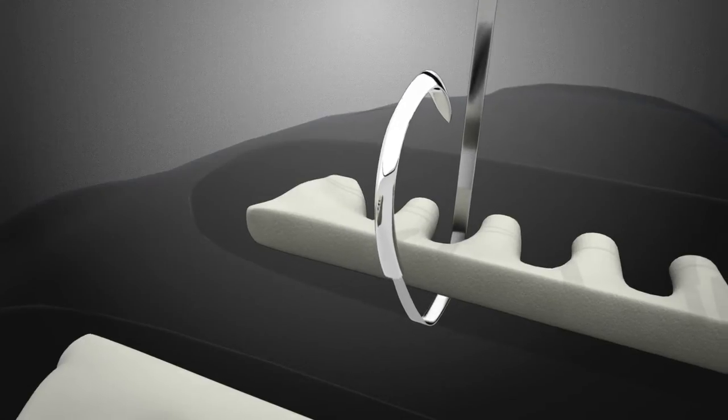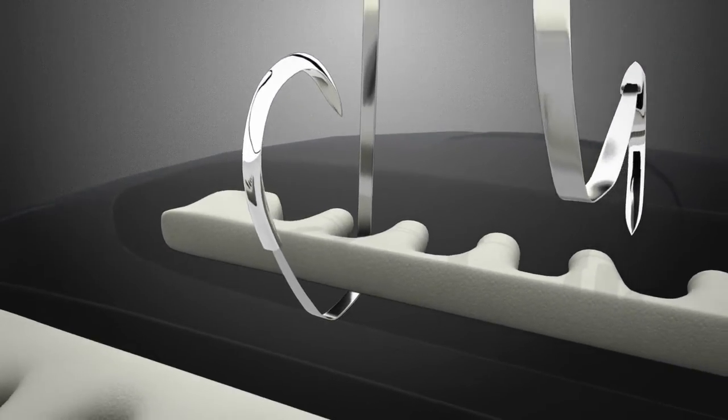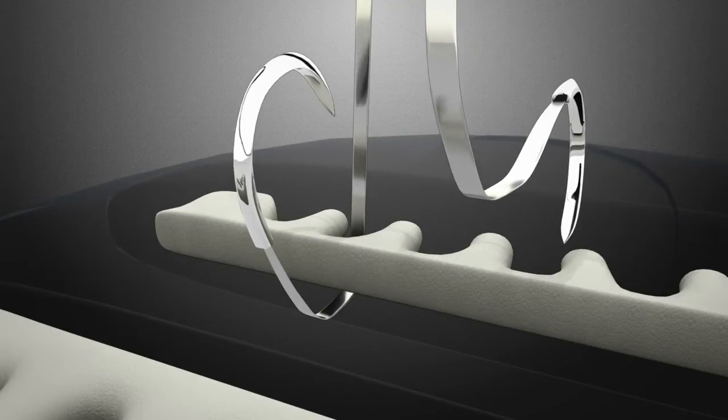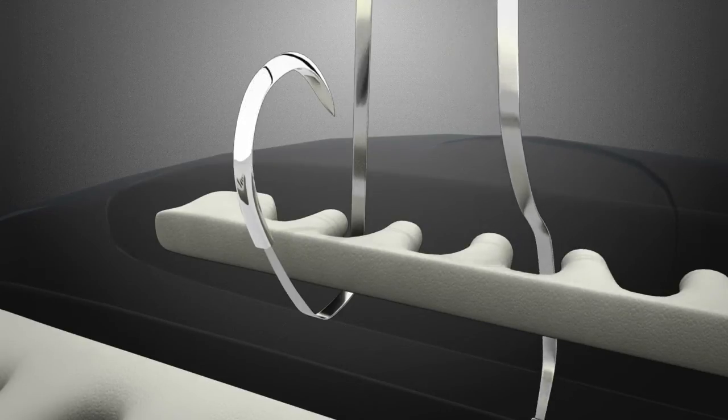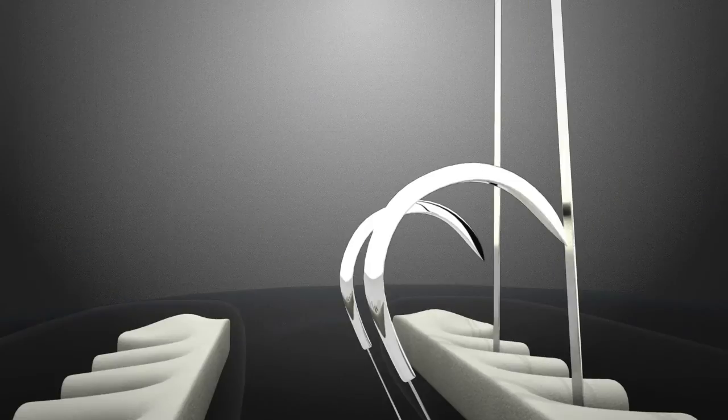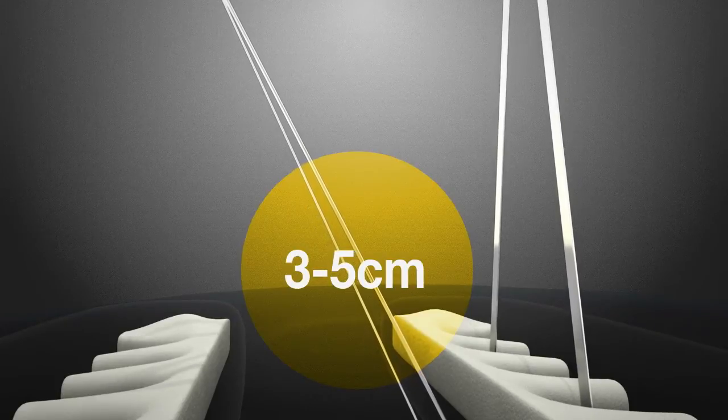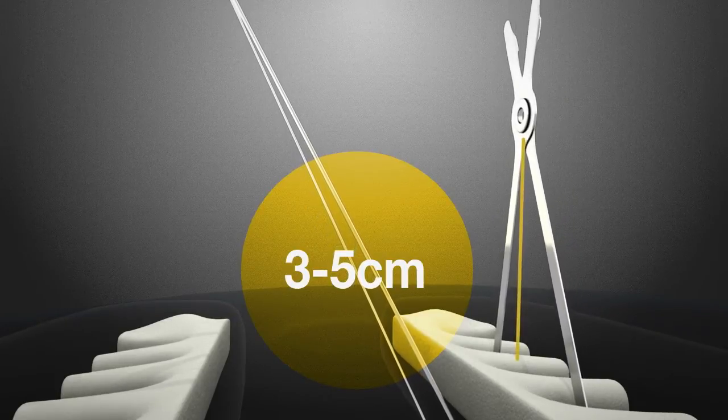The needle is secured and attention is then given to the second needle, or caudal needle. This needle is placed below the previous needle entry point on the far sternal half. Once it is through, both needle drivers are pulled at the same time to deliver the X-hub to 3-5 centimeters above the sternal tissue.